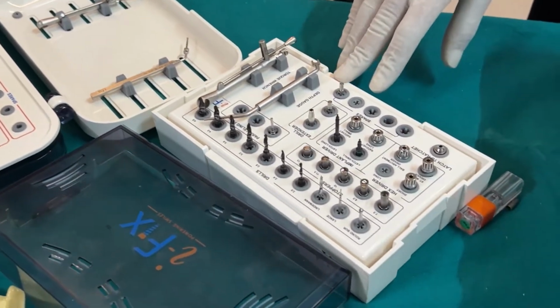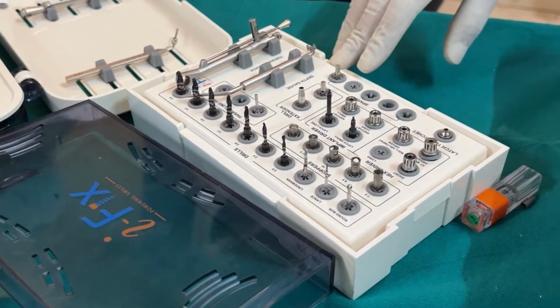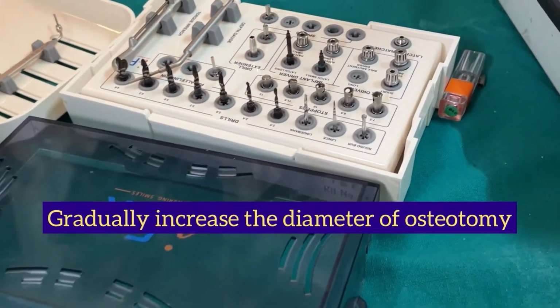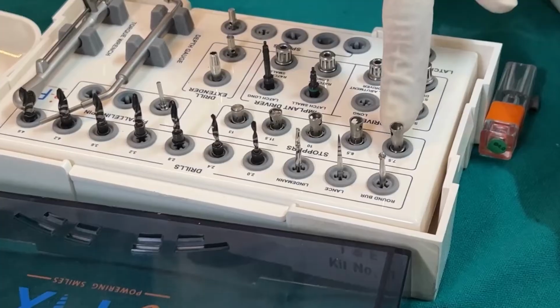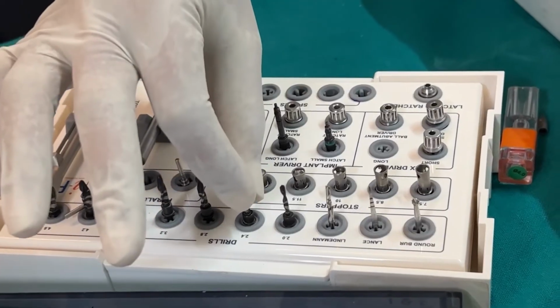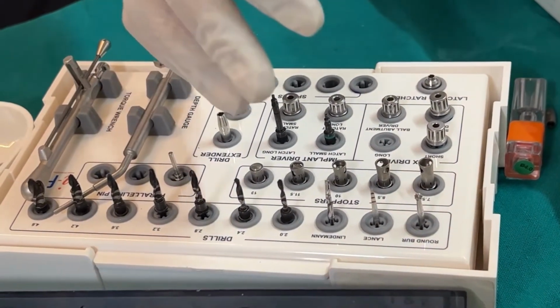So these broad parts, do you remember we had covered in the last video? The main component of an implant kit is what? Sequential drills. You need to gradually increase the diameter of the osteotomy. What is the next part? These are drill stoppers. Drill stoppers mean you don't have to count how much of the drill is going inside. You can blindly put the drill stopper and you will be able to do it easily.